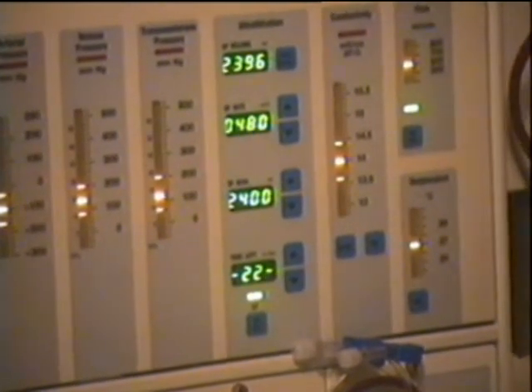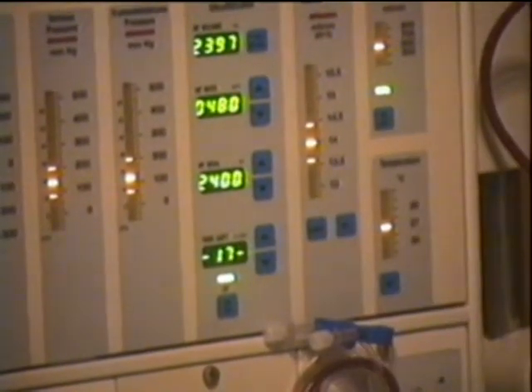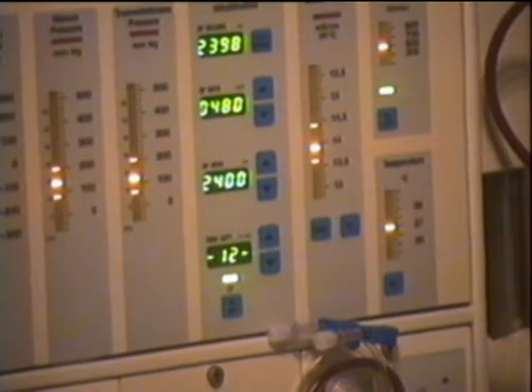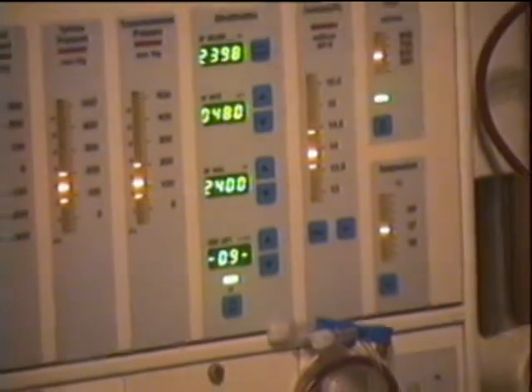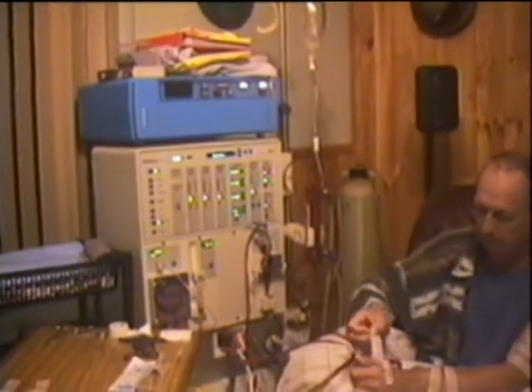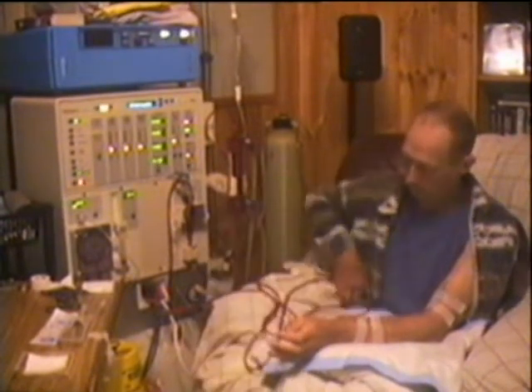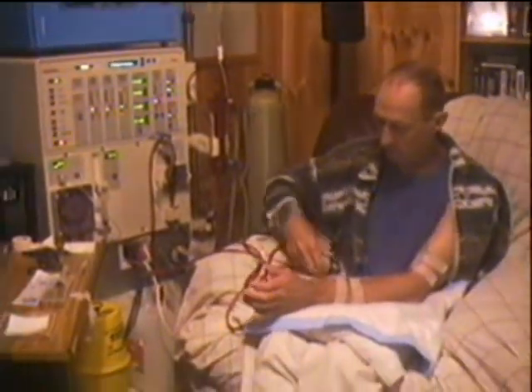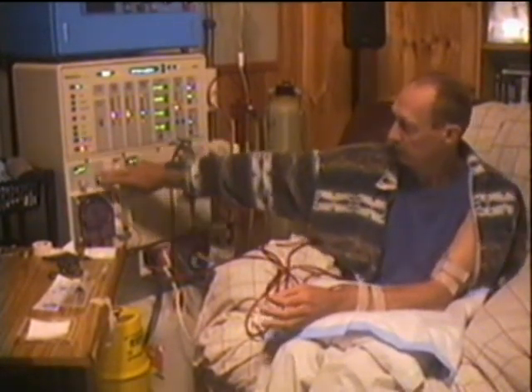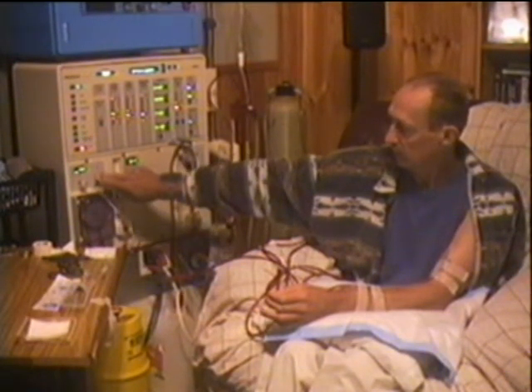So what I'll do is just get that on there, and get my special cloth ready, get my arm ready, and take that tape off. Now the machine's telling me that time's run out, so I'll just hit the alarm off. Now I have to dial it down to 180ml per hour.